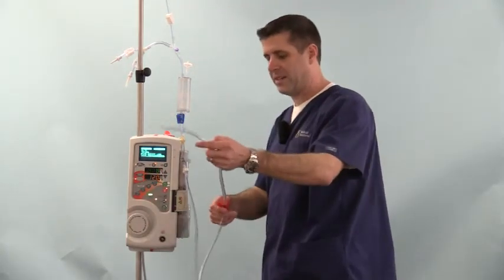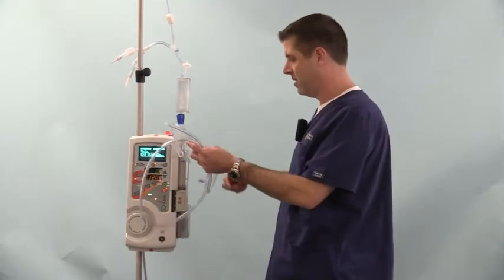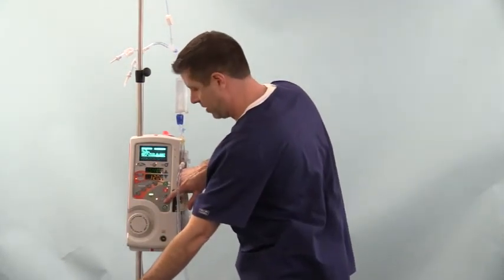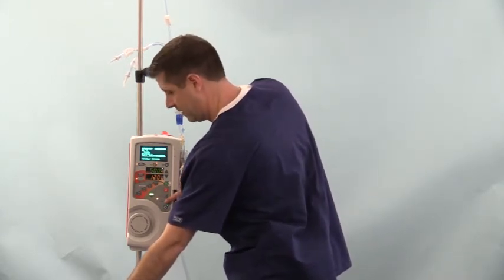Now the cassette is fully primed. I'll go through my auto prime. Now the last step is just a manual prime to visually inspect to ensure that all the air is out of the cassette. I'm manually priming, watching that all the air is removed from the patient line.